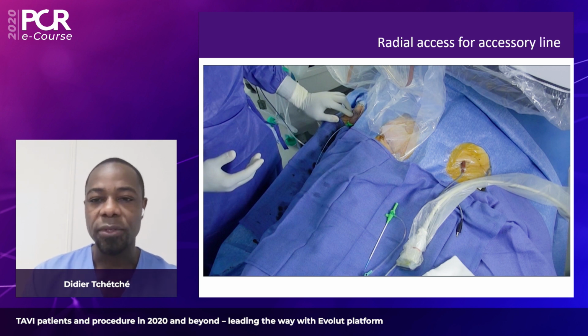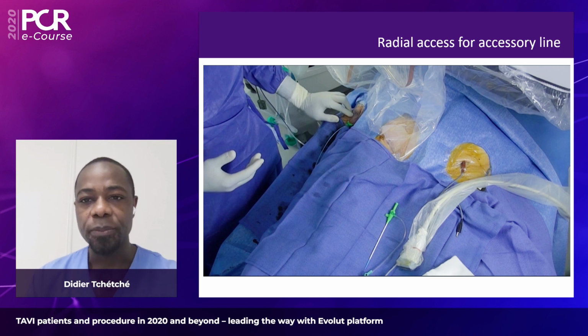So you also see that we have some pacing system on the left side. On the left, the secondary access. I'm going to go through it afterwards.